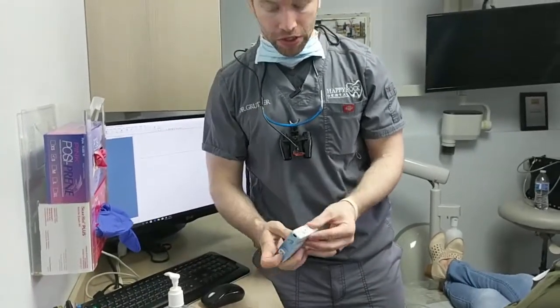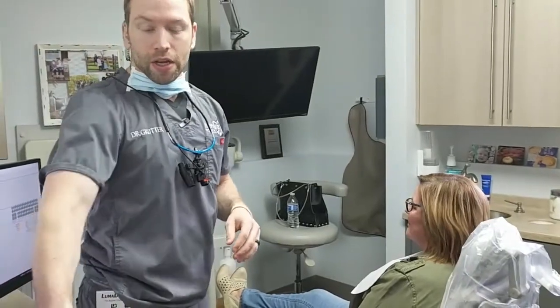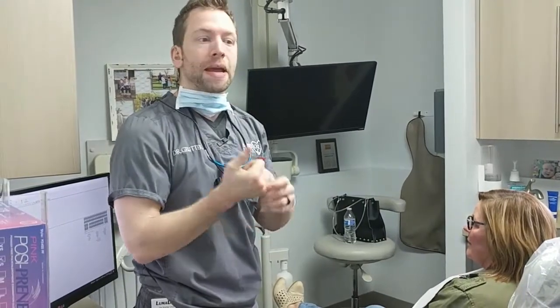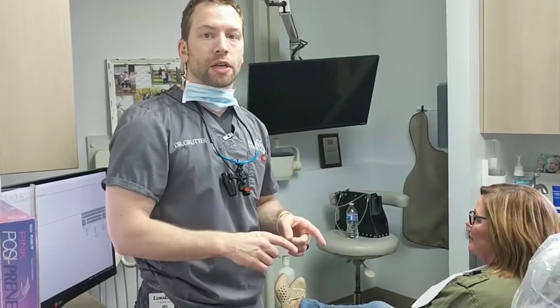I'm making a quick video of how to take a patient's existing denture and use it for a scan appliance. This particular denture — patient Lucy has allowed us to do this for education. This denture already fits great. We're going to be replacing it, but the fit on the tissue is great. If it didn't fit, we would do a hard reline first to make sure it fit, because if not, the surgical guide and anything from there is not going to fit well either. Since it already fits, we can skip that step — but know that would be the first step if you didn't have a well-fitted denture.